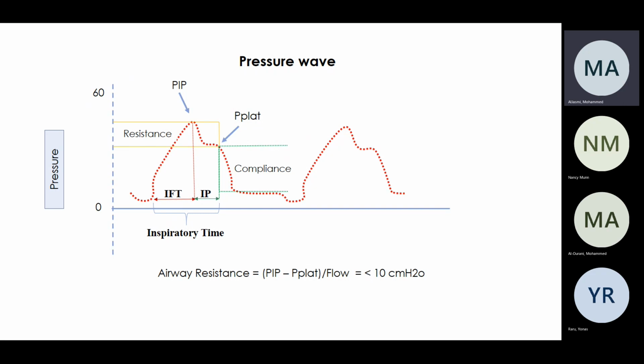So you check the compliance to make sure. That's the other problem. When you do an inspiratory hold, the patient can't breathe. You're blocking the valve, is that right? There is no air moving, but the patient can use accessory muscles. He can use his diaphragm, and that will lead to a non-plateauing line. It will go up and down, and the machine will just take the average or the highest and give it to you. So you have to look at the curve to see exactly where it's plateauing. When it's plateauing, that's when I take my exact plateau pressure, not just any pressure. Okay.